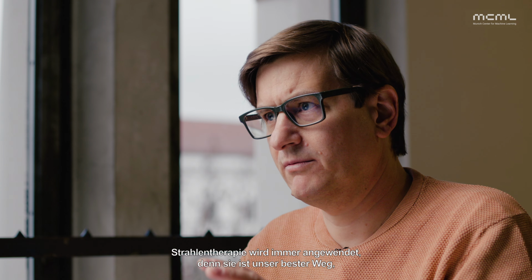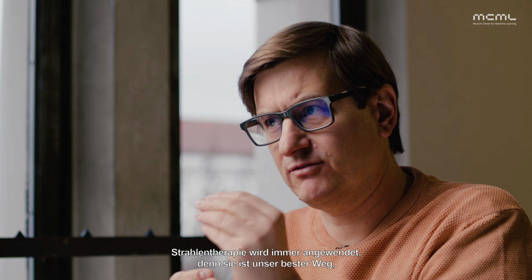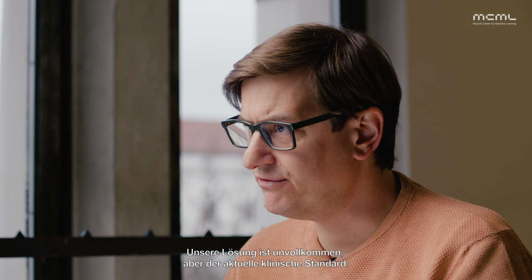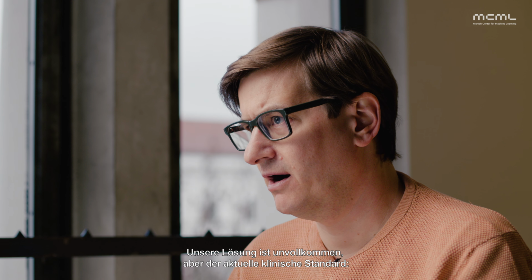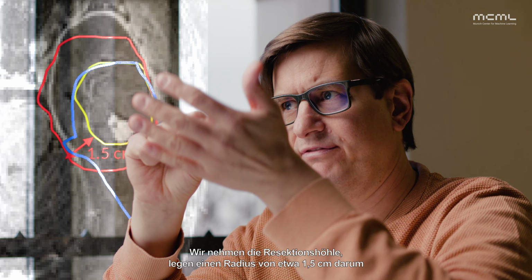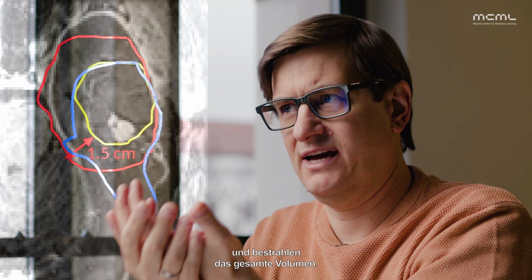So what we do next for this individual patient is we will plan his or her radiotherapy treatment. Radiotherapy is always applied because we know this is our best way of treating this invisible infiltration. But how do you target something that you don't see? Our solution, our imperfect solution and the clinical state of the art at this point in time, is taking the resection cavity, putting a roughly 1.5 centimeter ball around it, and then irradiating this entire volume.